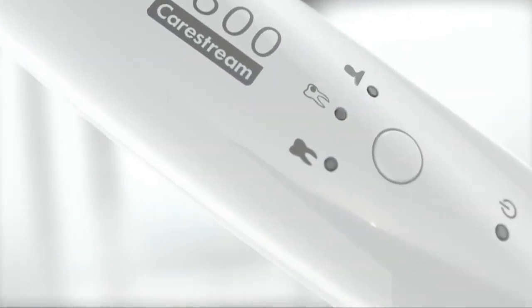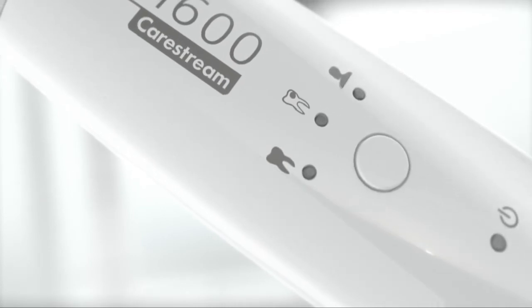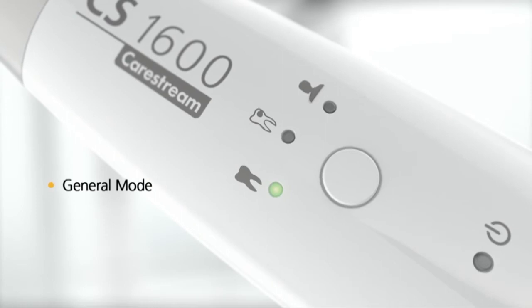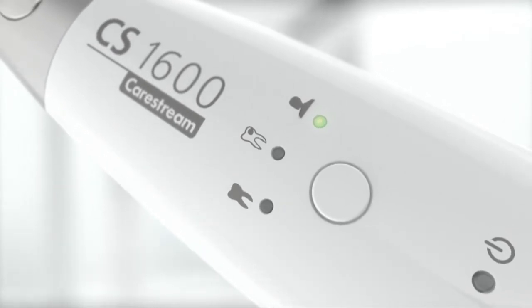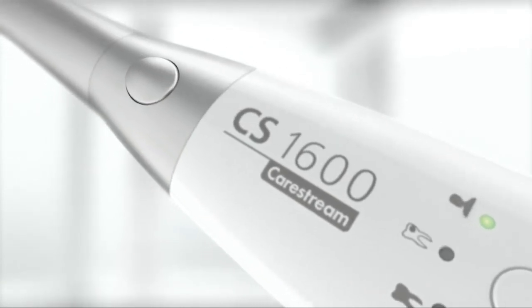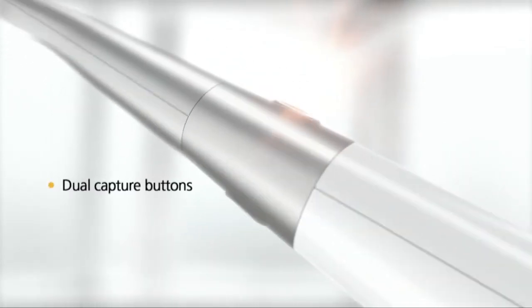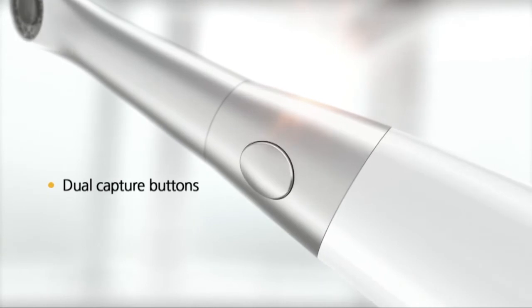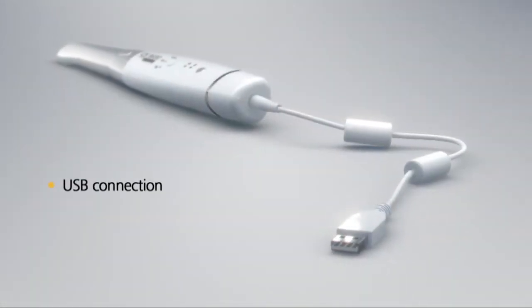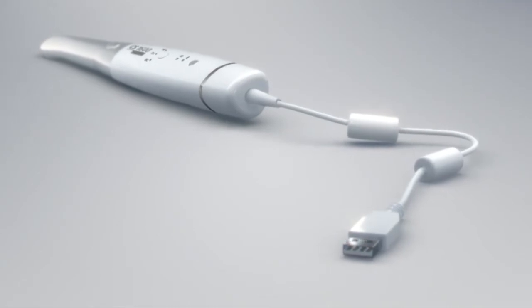Illuminated by a three-layer 18 LED system, the CS1600 operates in three modes: caries detection, general, and portrait, allowing you to perform a variety of functions with speed and accuracy. Dual capture buttons ensure smooth operation for both upper and lower arches, while a simple USB connection makes it easy to use and share within your practice.